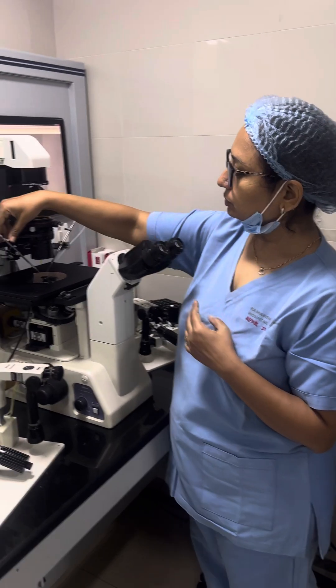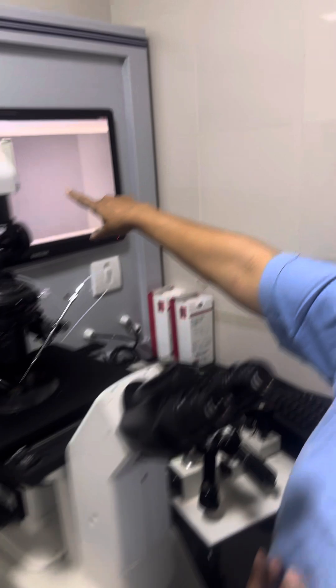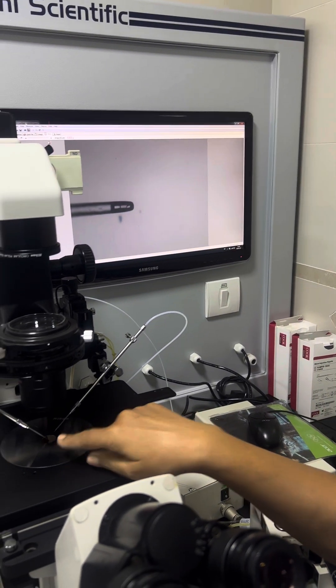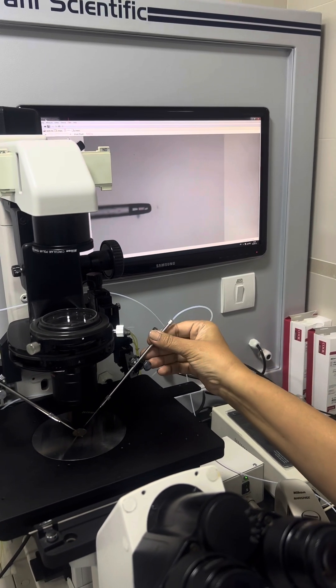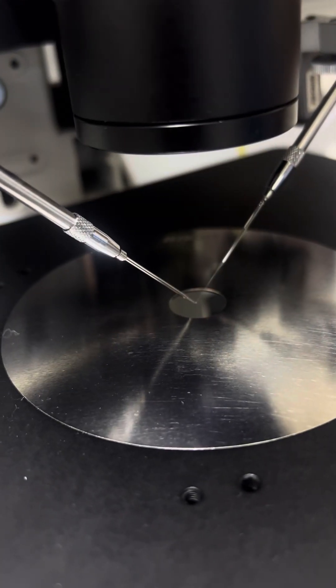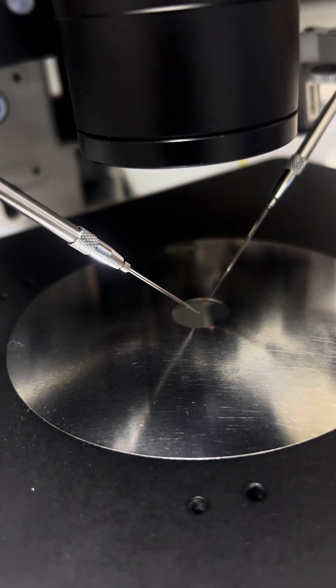And then first you have to adjust the holding pipette. The holding is the bigger pipette. You can use that pipette as a reference. And then you have to set the injection pipette.